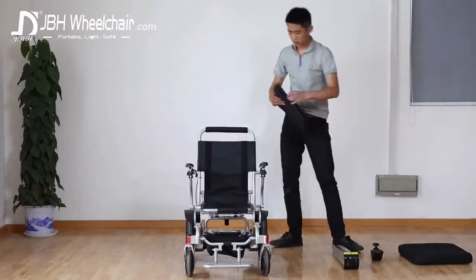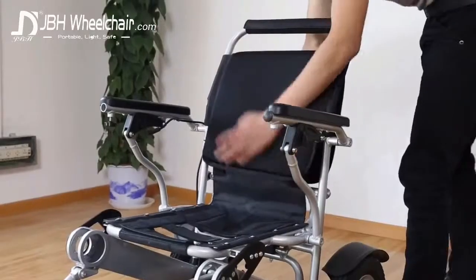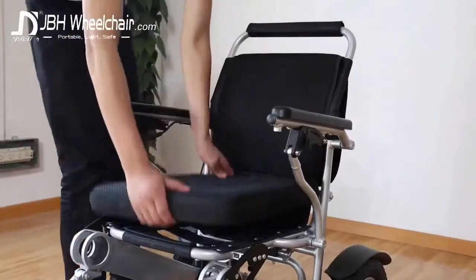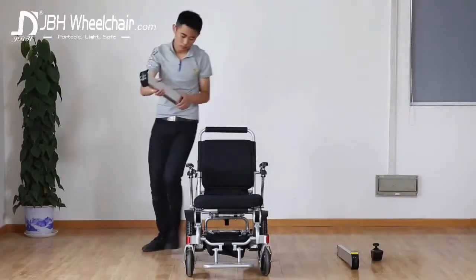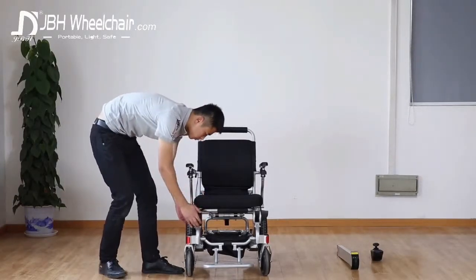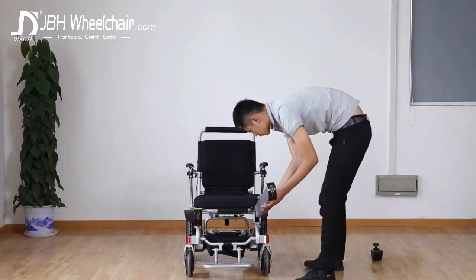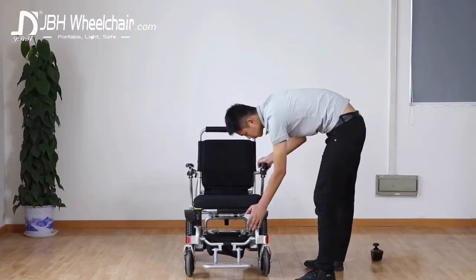We would like to introduce our JBH-D09 heavy-duty folding electric wheelchair. This model is quick and easy to assemble with separate backrests and cushion. The chair is delivered together with two batteries which slot easily and cleverly into the aluminum frame in perfect balance, and drive the two 250 watt motors within the lightweight but powerful chair.